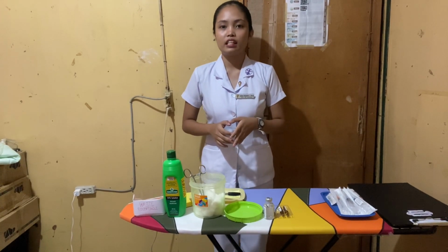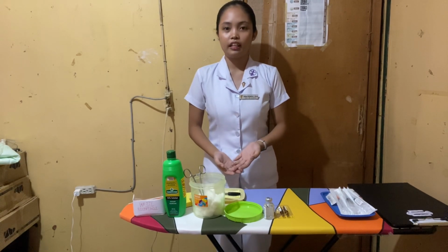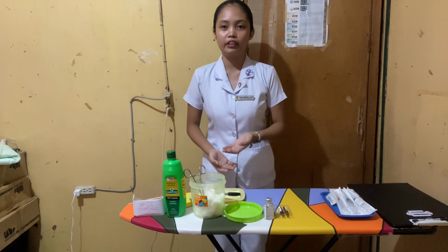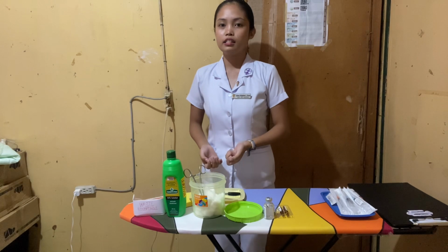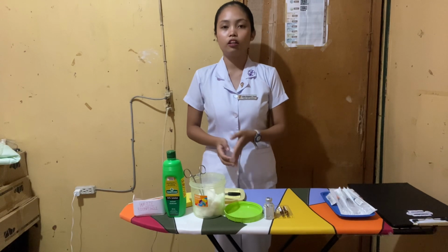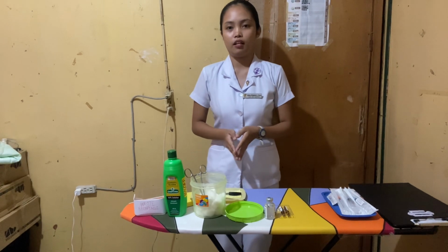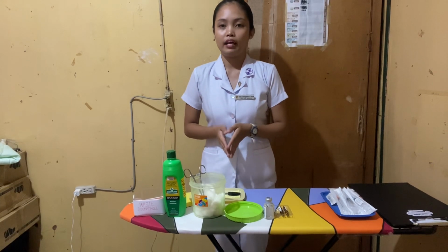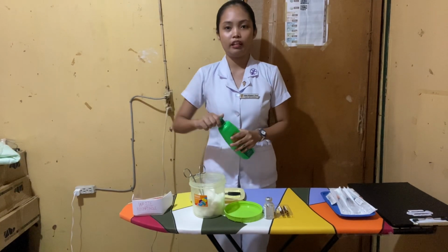So the equipment is syringes. I have here a tuberculin syringe, my insulin syringe and a 5cc gauge 23 syringe. Also I have my aspirating needle, my hypodermic tray and a forceps, my alcohol, sterile water which will serve as medication for this demonstration, cotton balls soaked in 70% alcohol, and waste receptacles. And now I'll proceed with the preparation of the medication from a vial. So before I do that, I'm going to perform hand hygiene to observe appropriate infection prevention.